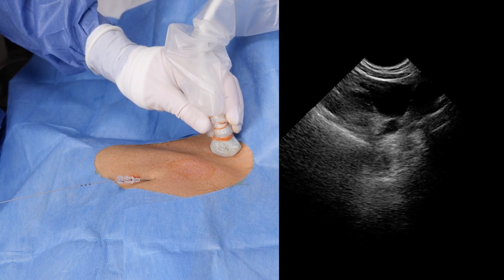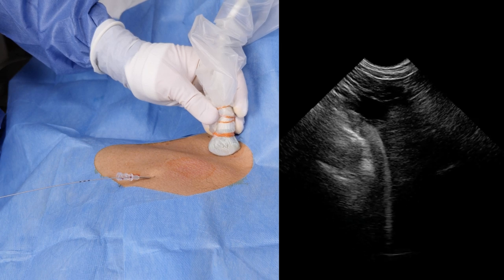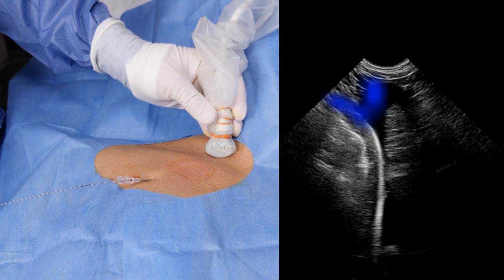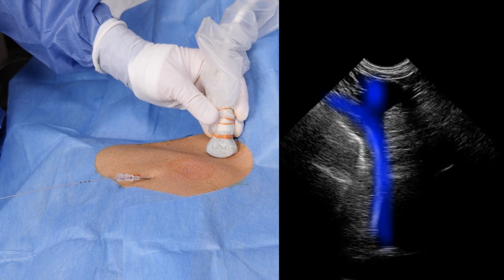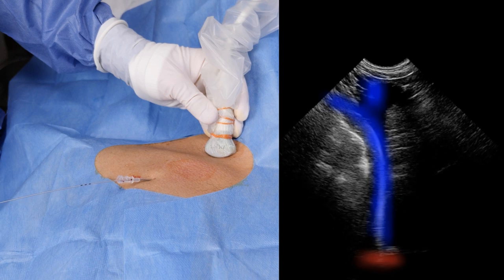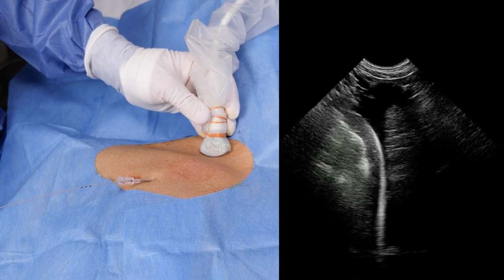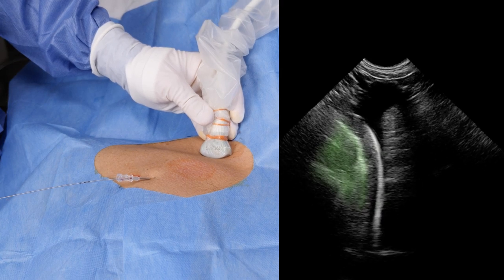As we tilt the microconvex probe caudally, the main benefit of this technique becomes apparent: real-time confirmation of the guide wire position. Visualize the internal jugular vein, the subclavian vein, and the superior vena cava. Also note the pulsating right pulmonary artery in the bottom of the picture. The echogenic guide wire is clearly visible in the desired location. Take care not to confuse it with the hyperechoic pleural line of the right lung, here marked in green.